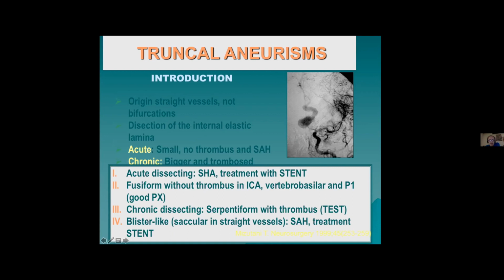And the blister-like aneurysm is sometimes the origin of hemorrhage, and it's very difficult to coil in this blister-like, and you need to close the parent vessel.